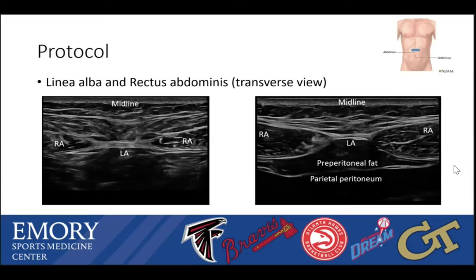It's flanked on either side by the muscle belly of the paired upper belly of the rectus abdominis. The photo on the left is immediately subxiphoid, with the right photo at the linea alba at the widest portion of the upper belly of the rectus abdominis, so just a few centimeters inferior. As you can see, the linea alba becomes much clearer in this area and it's relatively hyperechoic. In some patients, you could see widening or disruption of the linea alba that could suggest pathology such as diastasis recti, which of course we don't see in this patient right now.